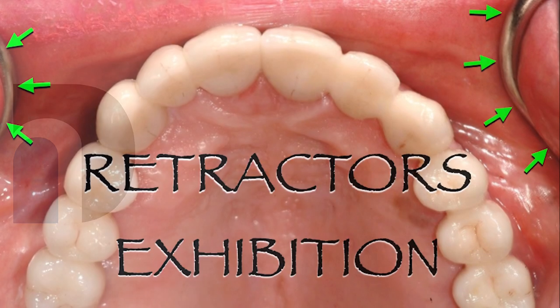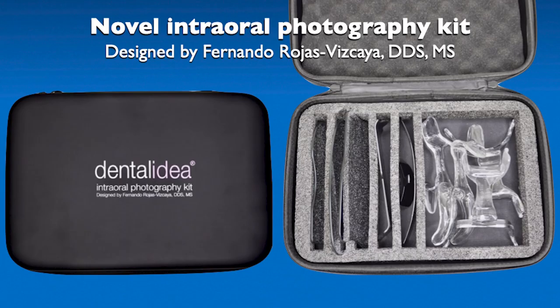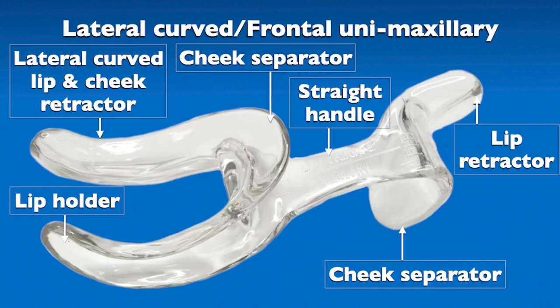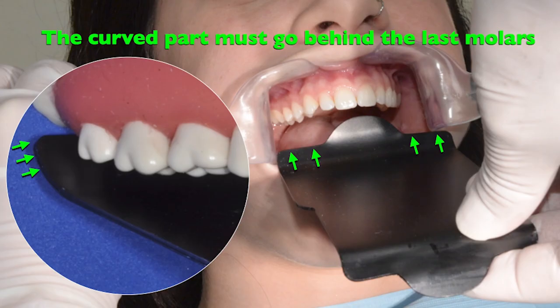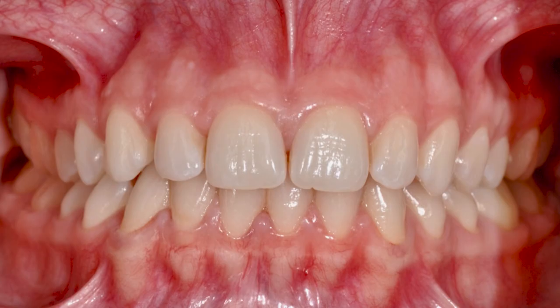In our photos, sometimes the edges of the retractor, the mirror, or even the lips appear. Now, with a new and patented Dental Photography Kit, with new design and more ergonomics, we can improve the quality of our photography.